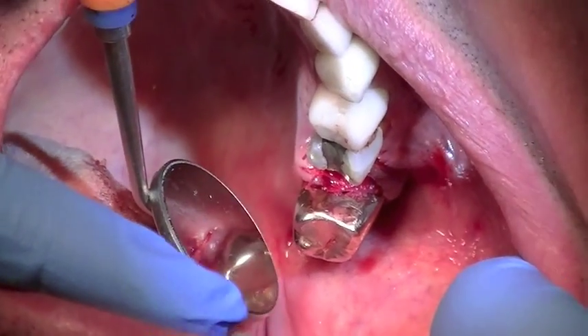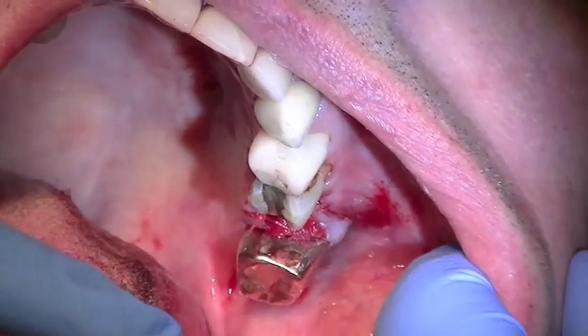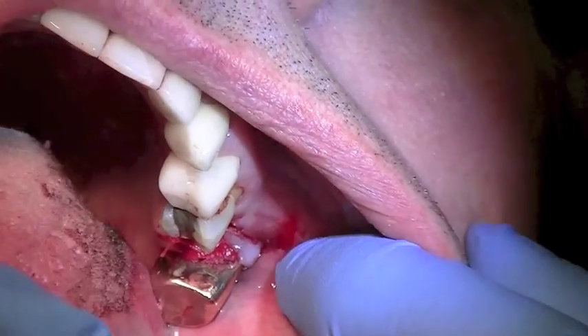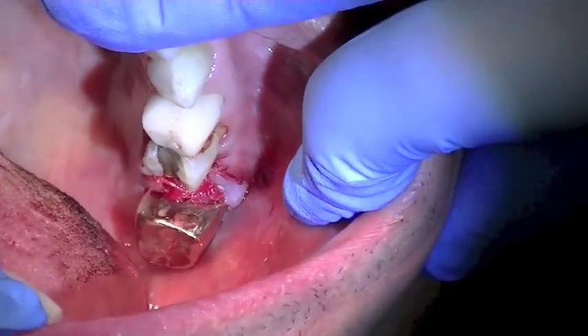I'll be removing these sutures at one week and then the membrane at four weeks. It's just amazing — you'll see the end results in four weeks as to how this membrane keeps the soft tissue from invaginating into that bone, and we'll have a nice bony matrix that's starting to form in four weeks already. We did an atraumatic extraction with the new physics forceps, which is just a brilliant technique. The adjacent teeth were not damaged, the bone is intact, and the patient will be ready for an implant in a matter of six months.